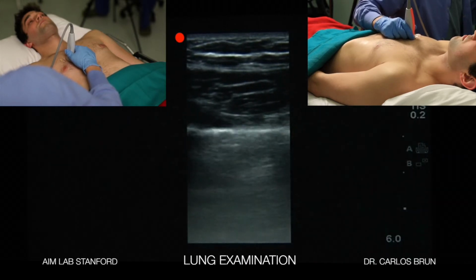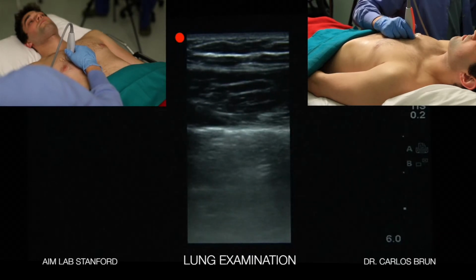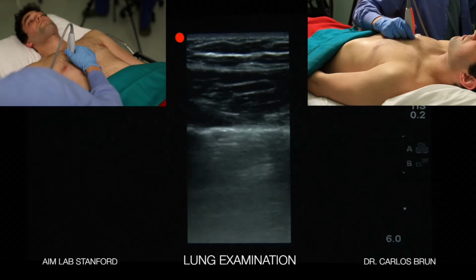This is the maximum depth that we can see. So you may not see some of the other lung signs, such as an A line, because you don't have a total depth. So we'll go over that again in the FATE examination.